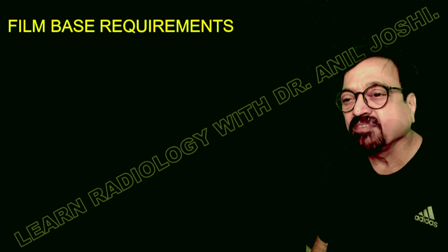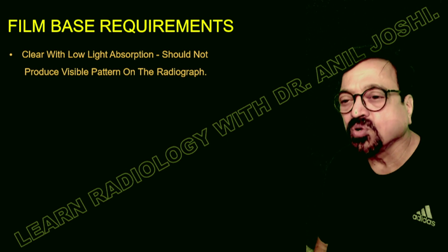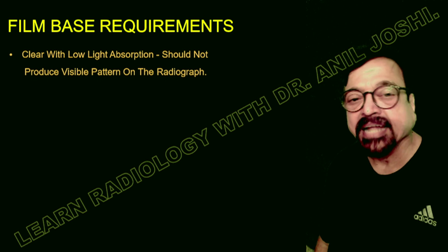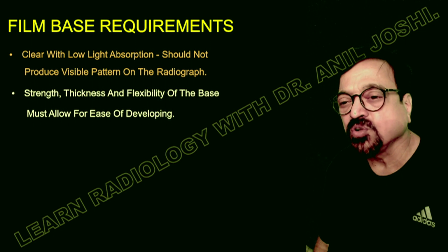Now, what are the requirements of film base? It should be clear with low light absorption, and should not produce a visible pattern on the radiograph. If the base starts producing a pattern, it will show on the X-ray film. It is very important that it should not produce any pattern. So it should not create any shadow.